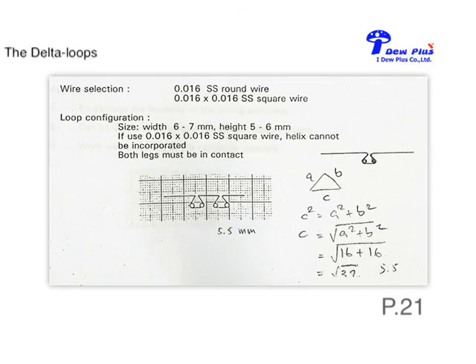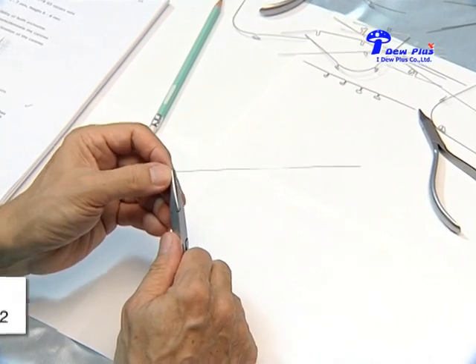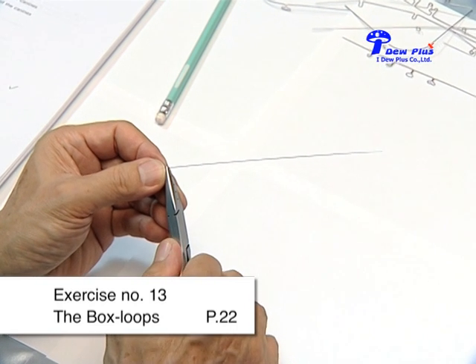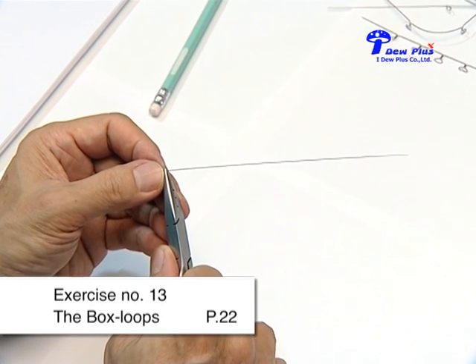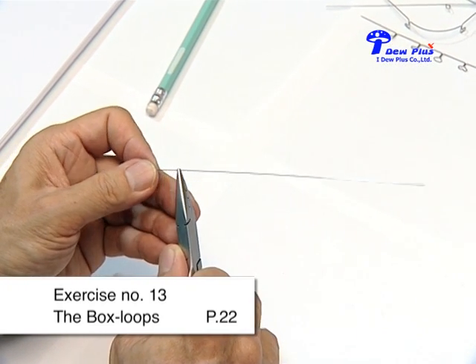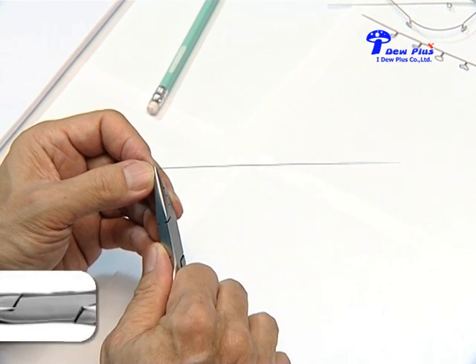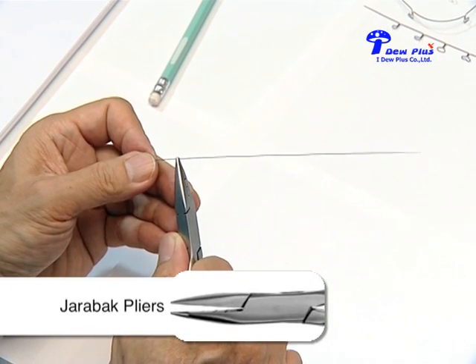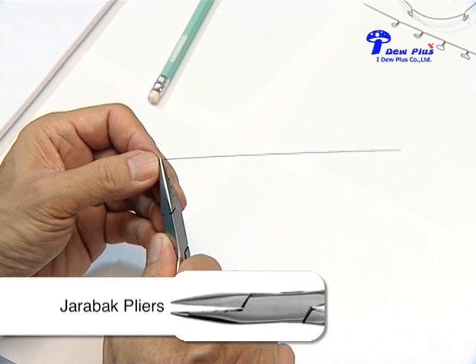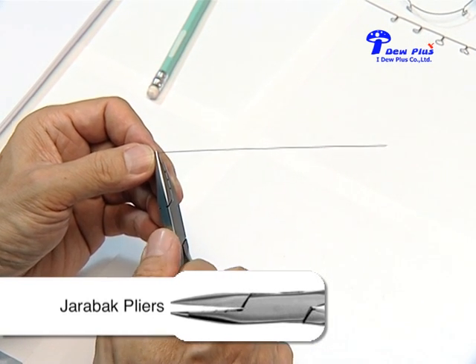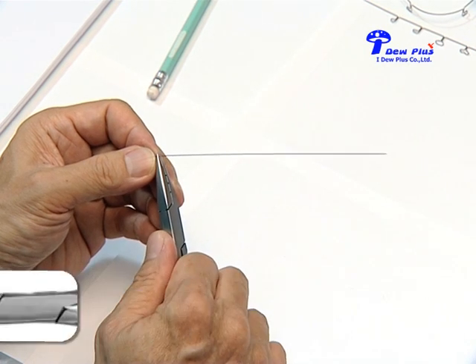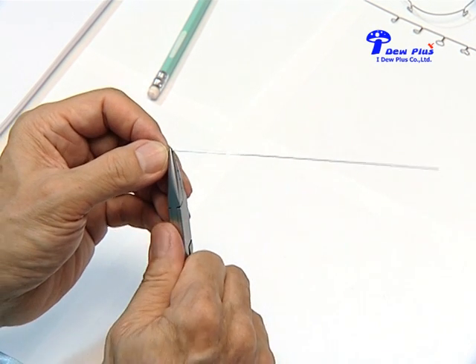Exercise number 12, the delta loop. Exercise number 13, the box loop. The box loop is used to align the canine. Its application is to increase the flexibility of the arch. It can be used to rotate and derotate the canine and to improve the mesial-distal inclination of the canine, as shown here.